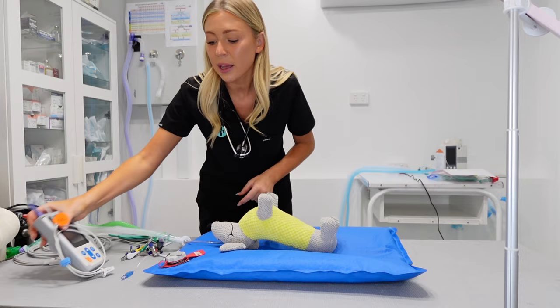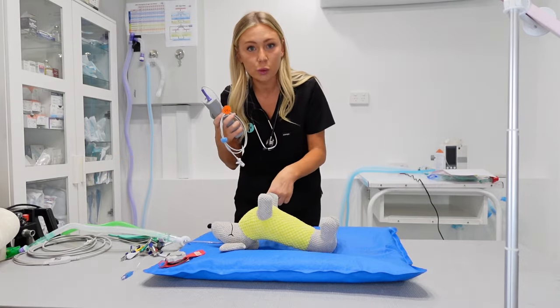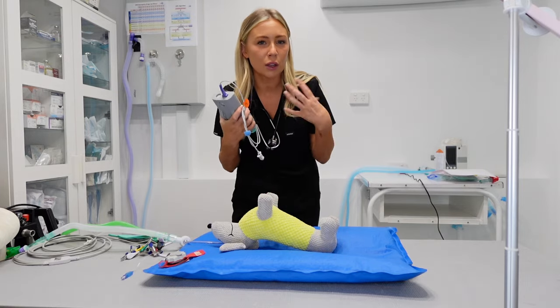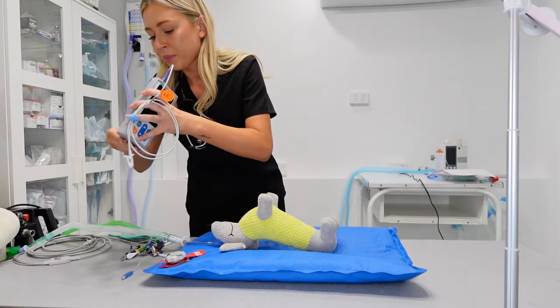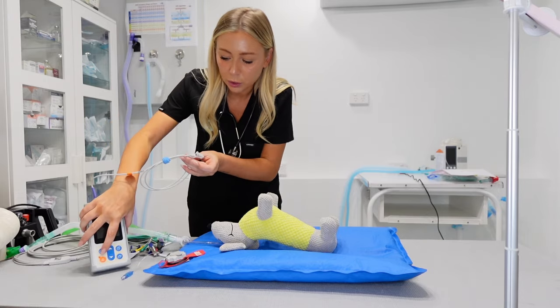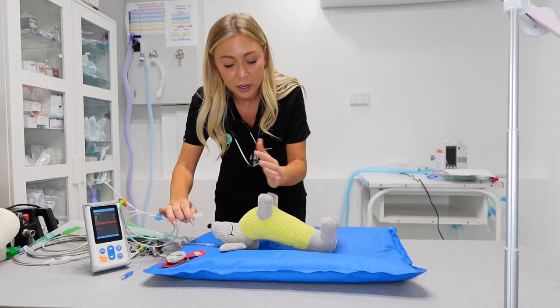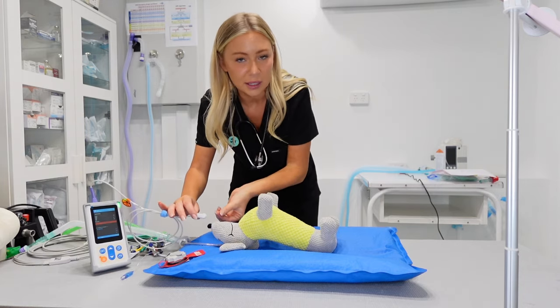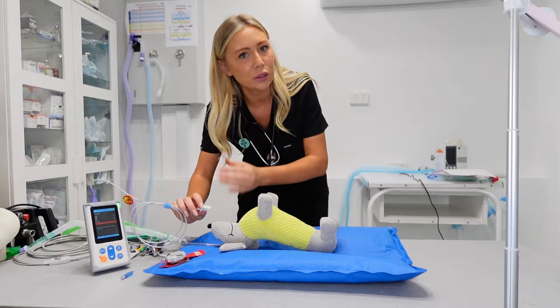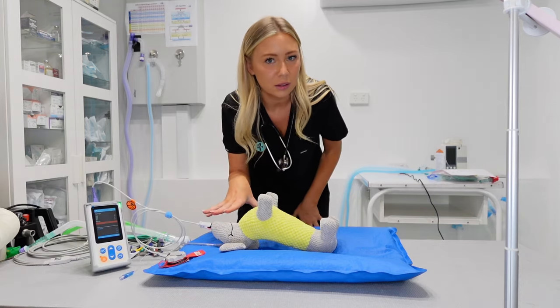Next one I'm going to attach is my SpO2. I just want to get a rough SpO2, making sure that the tube is in nicely and that we've got a nice oxygen level going on there, and pulse rate. So I would turn this one on and attach it. When we're in a sternal recumbency like this, the tongue is easy to access, so I would always go to the tongue first.